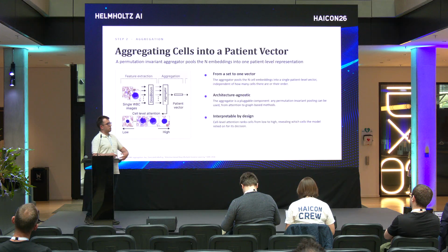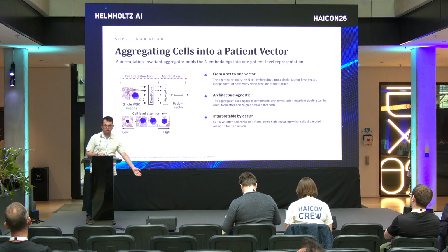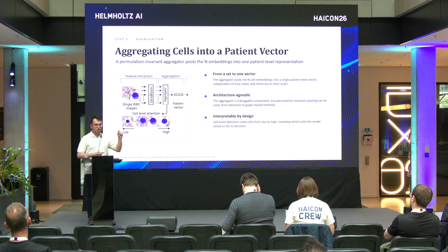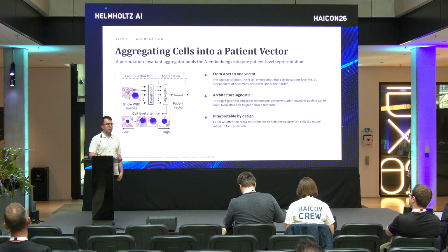Therefore, the community uses learned functions to aggregate these individual embeddings. It could be attention-based pooling, where one network scores each embedding, or you can use a transformer and take the class token. And then you can also calculate the attentions of the individual patches, which helps you to quantify the interpretability or how correct the model is.